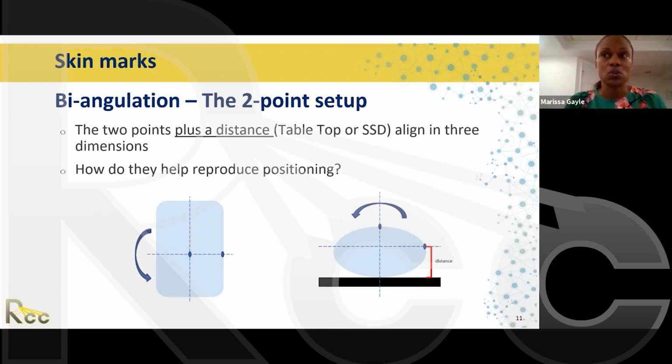We will then bring the patient into our CT sim. We'll make sure that the leg molds he needs, kind of like frog legs, are in place and that the patient is straight. Then we'll do a quick scan so the doctor can see that everything's in place. Then he'll start inserting the tandem and ovoid, and then we will scan again to make sure everything is in place. Our doctors that do brachy are male, so they need a female chaperone. So I end up being a chaperone, and we're just there to help along, make sure the patient is breathing and just helping out. And then we facilitate with the scan.